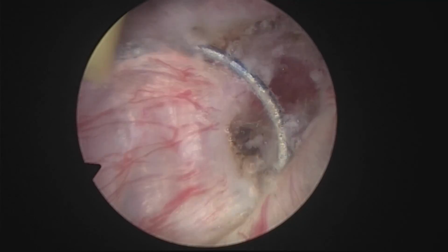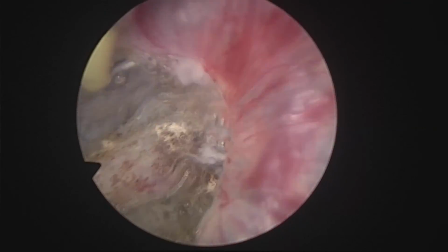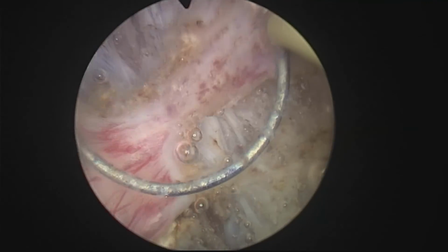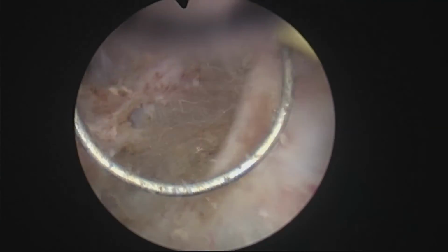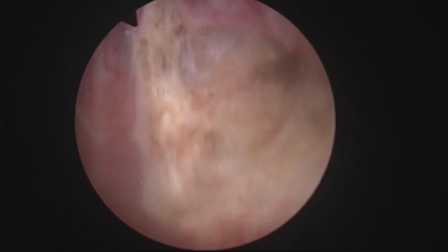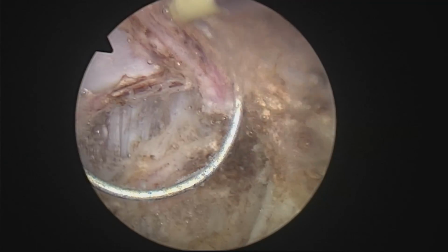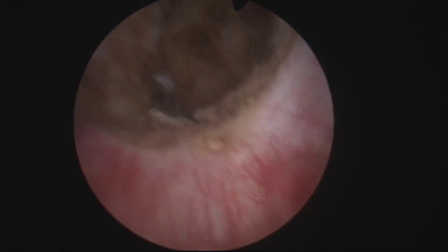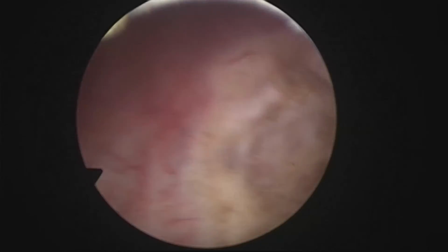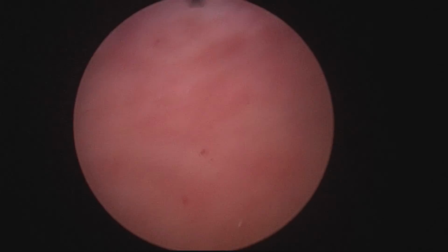I think it's interesting to see how TURP, that is considered by many as the best endoscopic treatment for BPH, also has its problems. And in this case, this man has a stone in a diverticulum due to a forgotten chip of tissue inside the diverticulum. A stone has formed, and inflammatory or maybe dysplastic changes have taken place in the mucosa of the diverticulum. So this is my treatment for this case. The 2 diverticulums are fulgurated, coagulated, and we will keep a catheter for 3 days, 4 days to see if we can end with this or improve the situation.